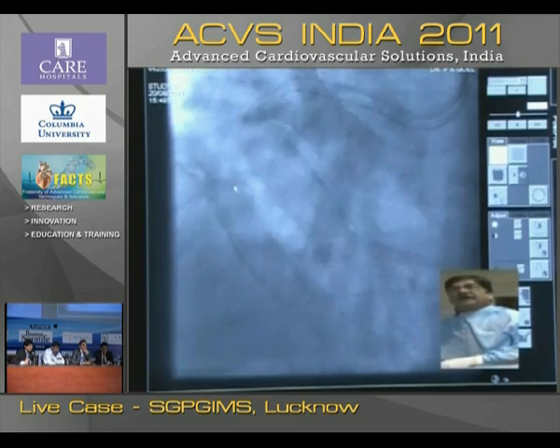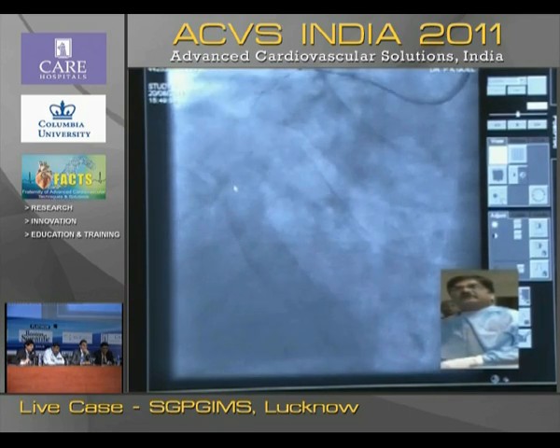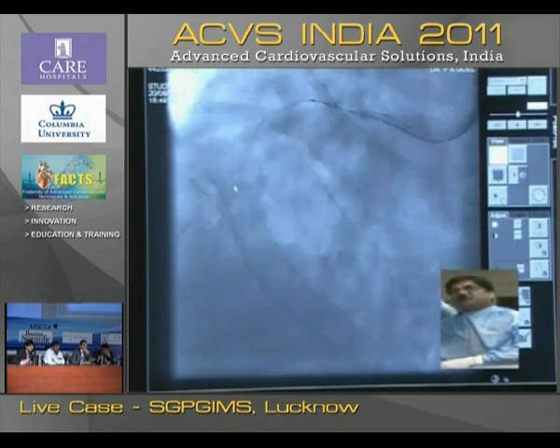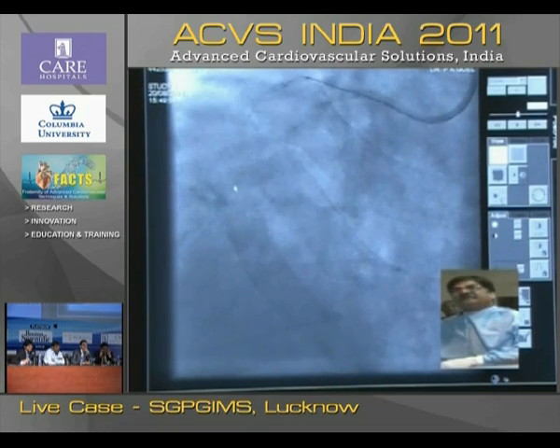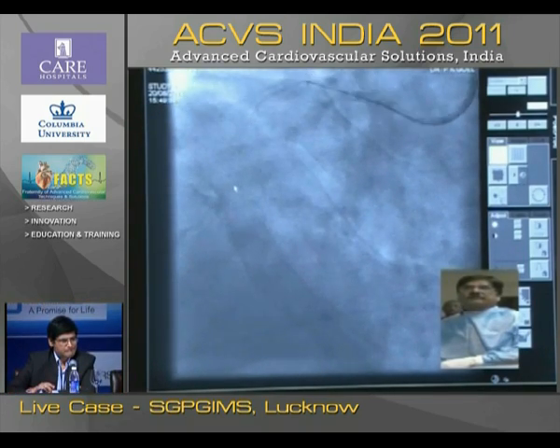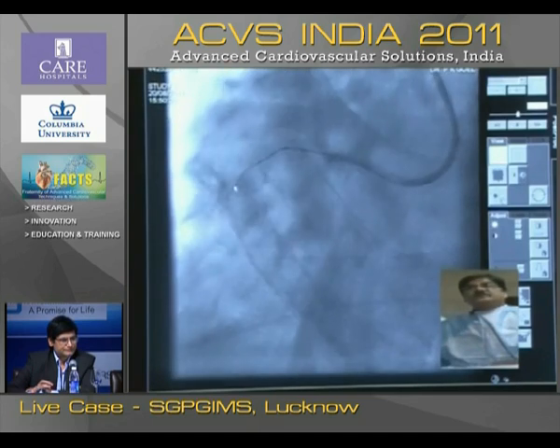So you feel it is going in the right direction? It seems there is resistance at the distal cap. Because you see the distal fibrous cap is another part which is difficult to penetrate. Yes, so I think it is. You have to exchange with a harder wire, because it was stuck there in the hard tissue. That's what I feel. I'll try to get the micro catheter forward if it is possible.